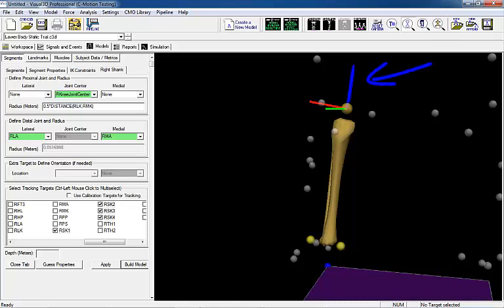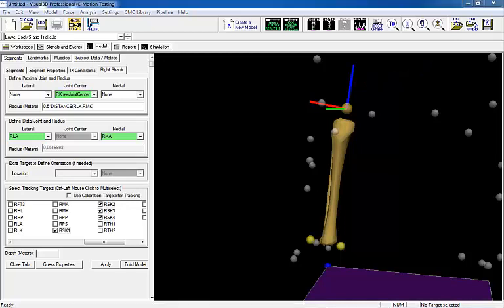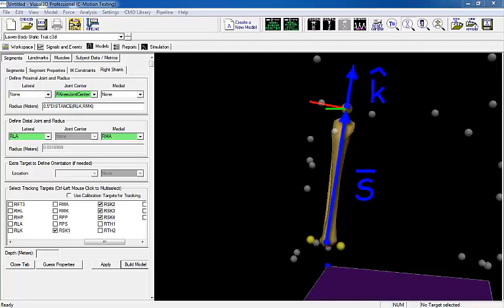Visual 3D first defines the distal-to-proximal axis by finding the midpoint of the distal and proximal ends, drawing a vector s between these two points, and finding the unit vector of vector s.